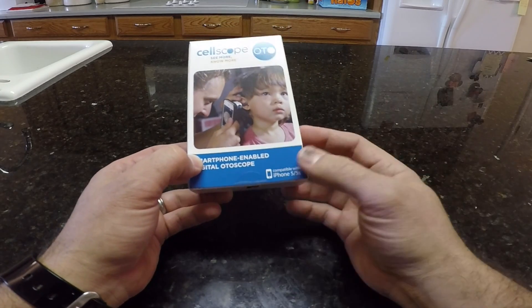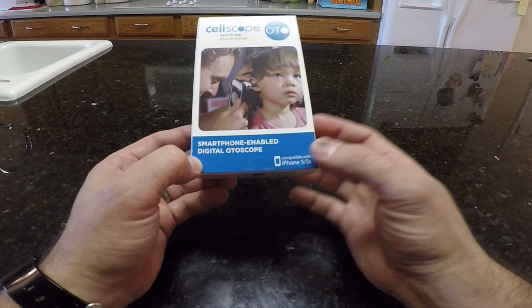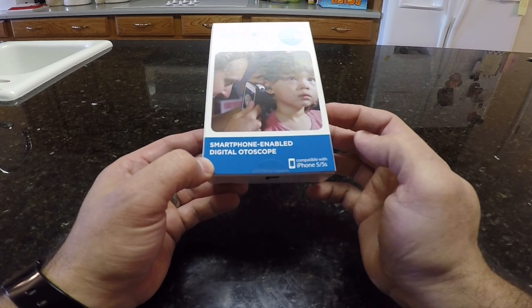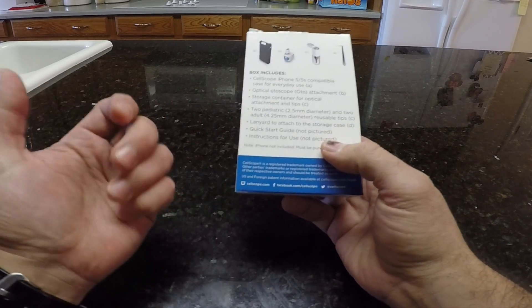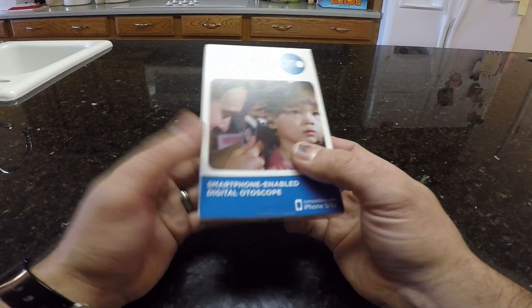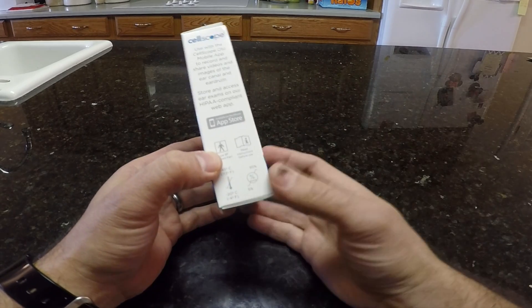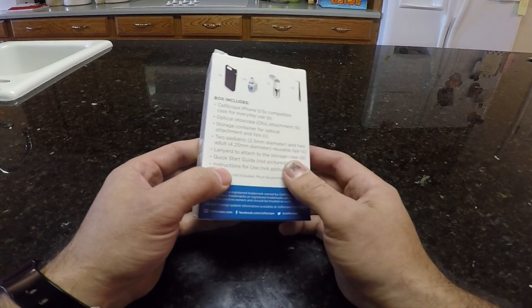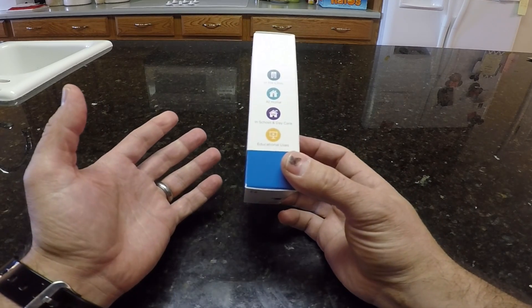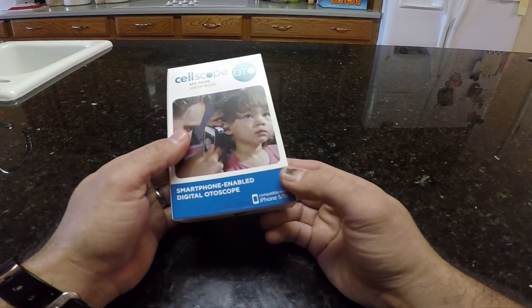You do have to be in healthcare and provide evidence of licensure to actually buy this, but this is pretty cool stuff. Essentially, what it does is a box that links to the camera and can be used as an otoscope to examine the ears. The advantage is that by having the camera, it gives you the option to save pictures to show the parents what you're seeing. It also, if you're a medical provider, there's a link to a HIPAA-compliant web app so you can save studies and load follow-up images on the same patient. Not only that, it eventually is going to be made available to patients so they can acquire images to send to their doctors to be diagnosed with otitis media and stuff like that.